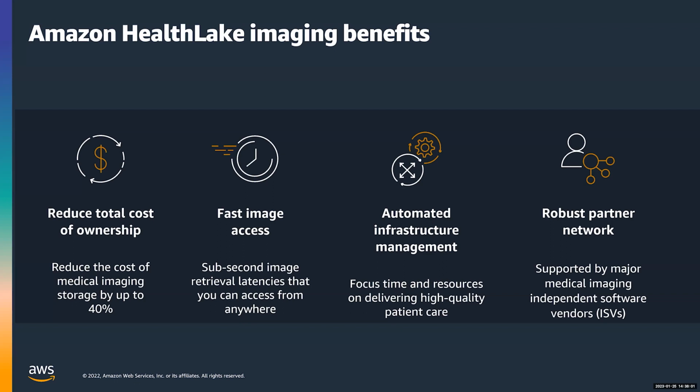So when you actually use software vendors for medical imaging systems, such as a PACS or a VNA, oftentimes these applications are going to store the data on different storage, and the storage will be on-prem. That could be a NAS, that could be a SAN, could be a warm storage, whatever the application can integrate with. But that storage is not necessarily safe and sound because it's on premises. And even if you do manage to protect it from cybersecurity threats, you can barely make sure that it will always be protected from environmental disasters.